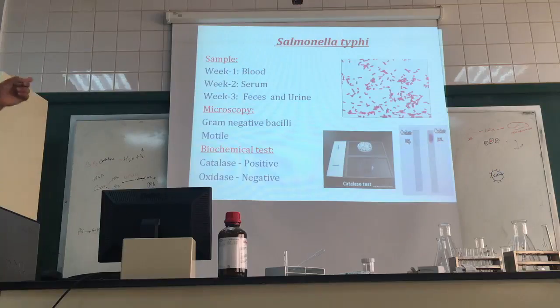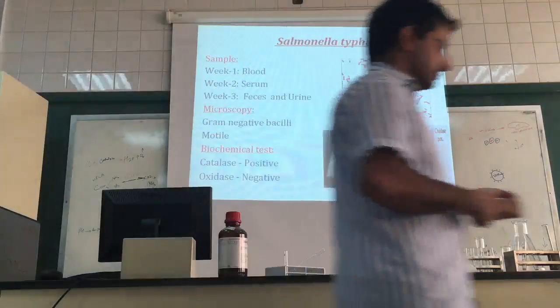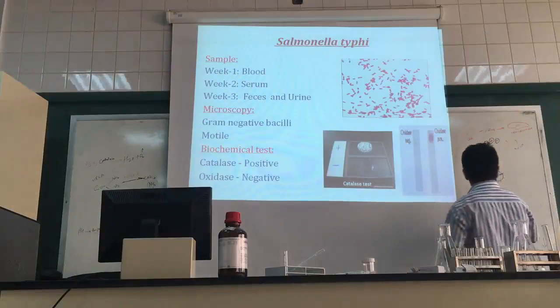And if you go for the gram stain, you will find it's gram-negative and motile. It has many flagella, peritrichous. It is catalase positive and oxidase negative. So what is catalase positive? Quick. Catalase. Yes. What is catalase positive?